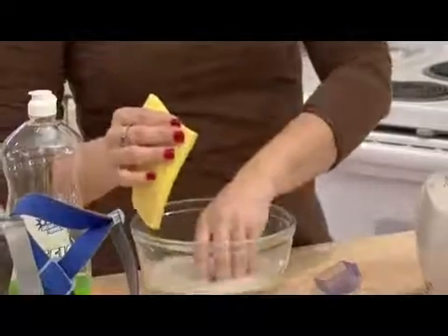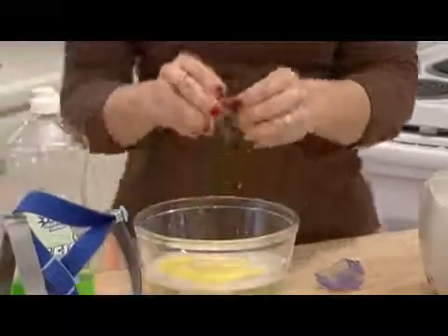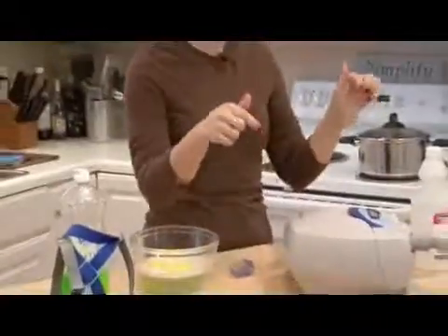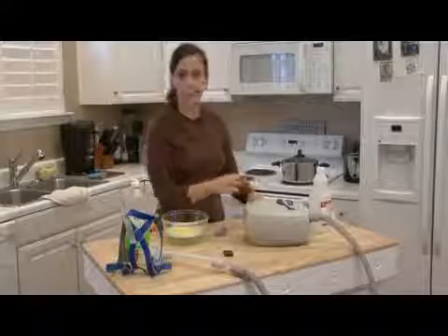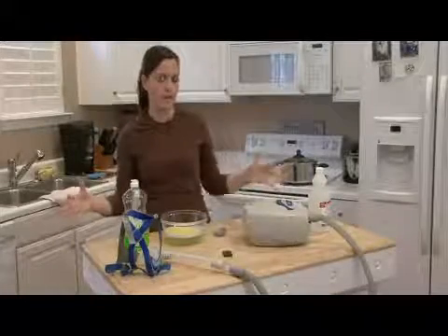You want to wash it off really good. Rinse it really well and let it air dry. You want to do this about every 2 weeks. Now, as for the other filter that's on the inside of the machine, you don't clean it. That filter is white. You don't clean it. You do replace it every 30 days.